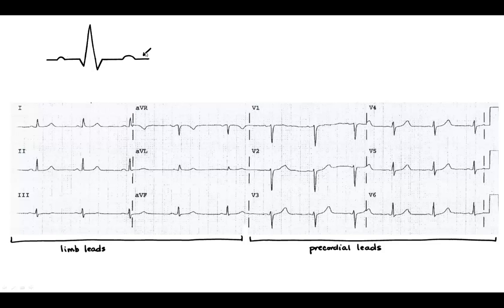So let's say we looked at lead 1, and lead 1 goes again from here to here. And what we see is that there are 3 peaks in this particular span of paper, and the 3 peaks actually represent 3 cardiac cycles that got recorded before the lead switched over. So if we were to mark out 1 cardiac cycle, let's say we pick this wave. So this span right here is 1 cardiac cycle.